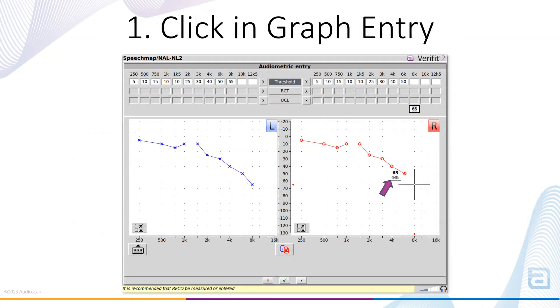The Legacy Mouse Click-and-Graph method now shows a dBHL level and frequency in a box near the mouse cursor, making it easier to determine the frequency and associated dB level being entered without needing to look at the table above. In addition, there is click-and-drag operation, where upon left-clicking in the graph, the cursor speed will slow to enable finer selection of the desired threshold.